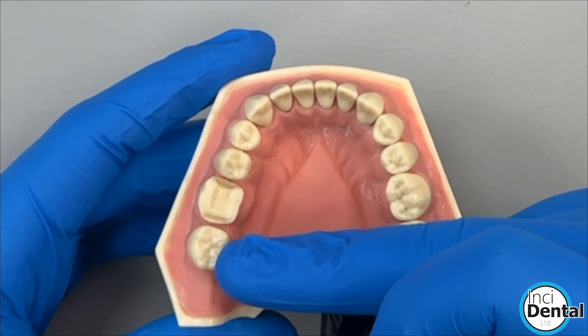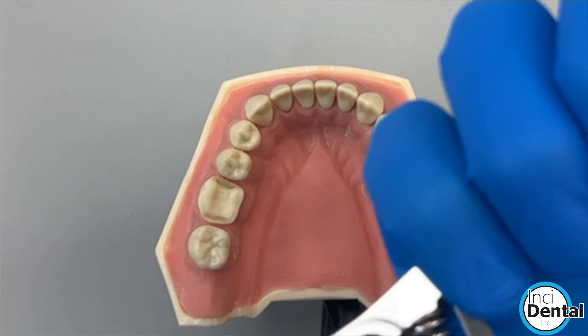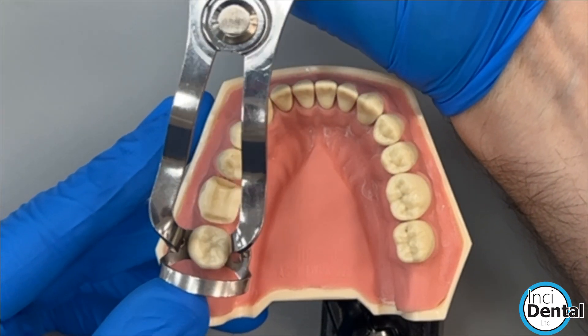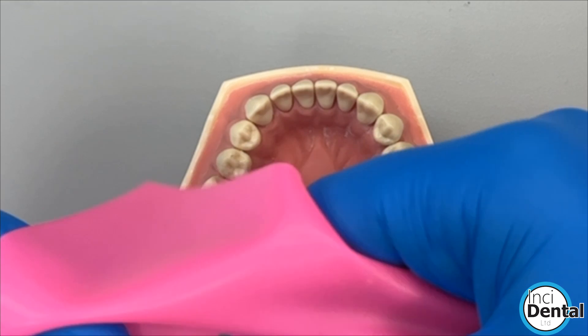The way we start is we're going to isolate the quadrant and we're going to put an anchor clamp on the tooth behind. I'm going to go with a clamp-first technique here. I usually use a B1 clamp for lower second molars, and then we're going to stretch the clamp over.